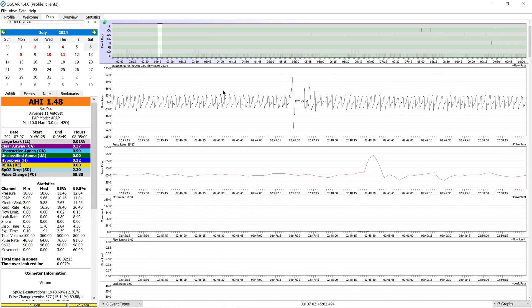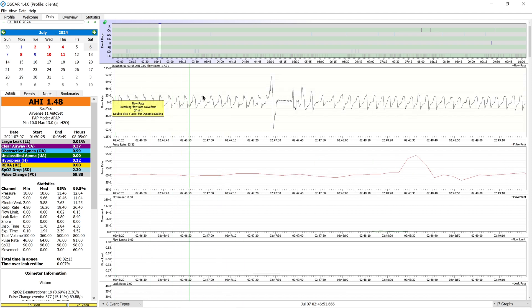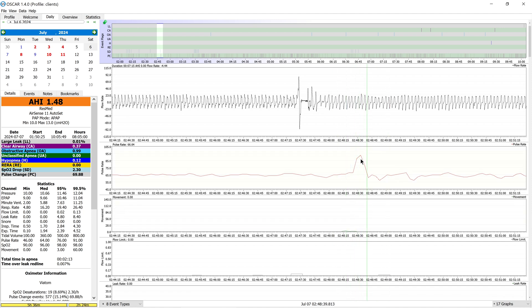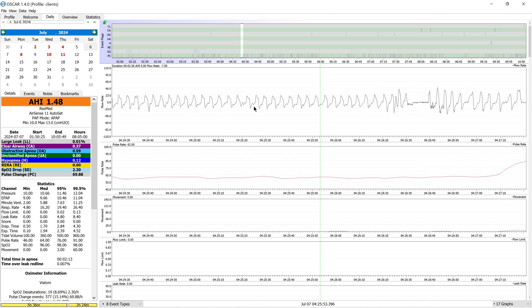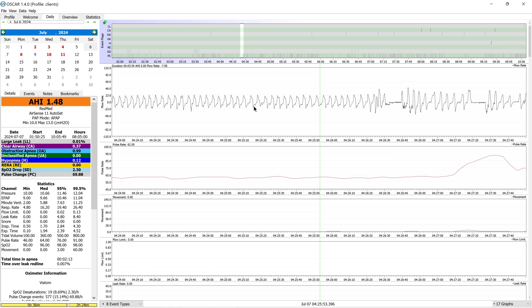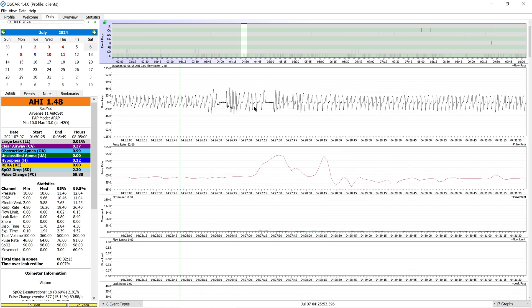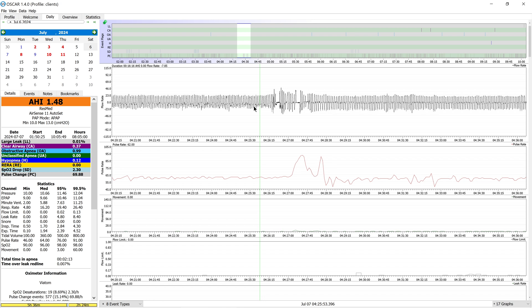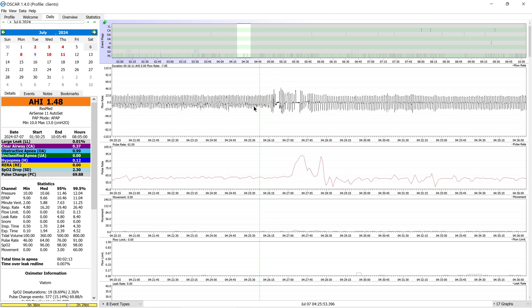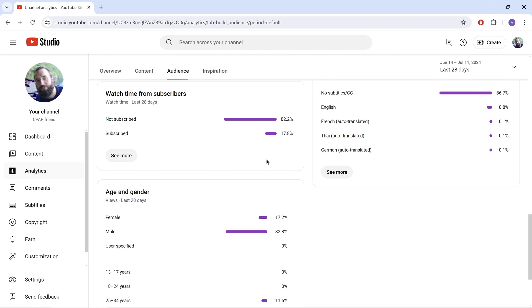Just to really drive this point home, here's a completely different night. Flow limitation, flow limitation, flow limitation — huge recovery breath, sleep-wake junk — and slightly thereafter a tiny bit of movement but a huge pulse spike up into the 90s. Here's another one: very clear preceding flow limitation slash bad breathing, tons of sleep-wake junk — you can call some of those recovery breaths — with massive pulse spikes up to the 90s once again. You can also compare the pulse and movement profile for events that are flagged versus those that are not. But do you know what's even more fascinating than pulse oximetry data?